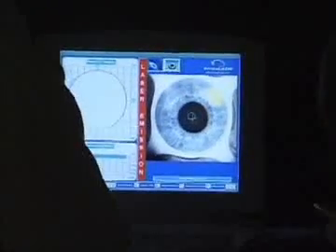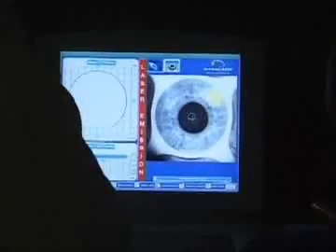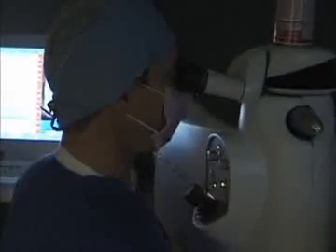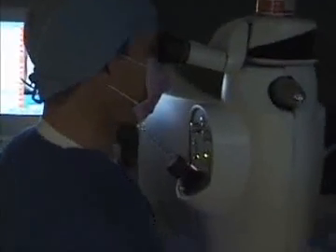LASIK is a way of correcting refractive error. What we're doing here is using the laser to re-sculpt the cornea, and by doing so we can focus the light directly on the back of the eye. Usually with LASIK we can get rid of astigmatism, nearsightedness, and farsightedness.